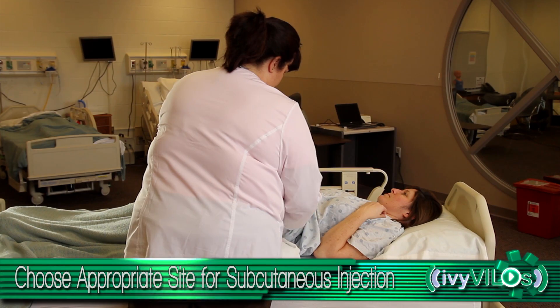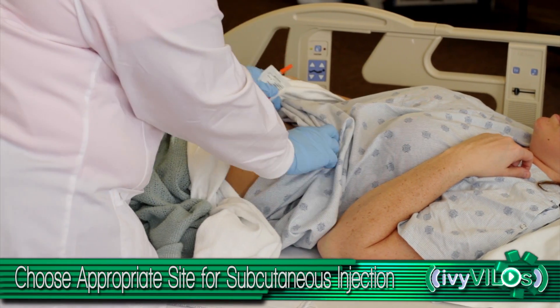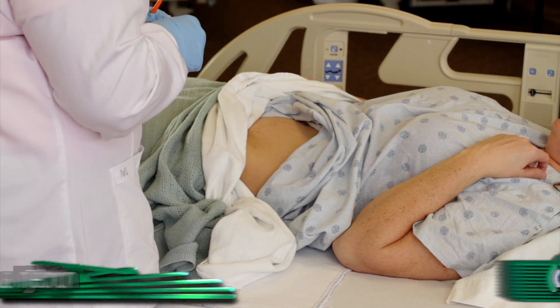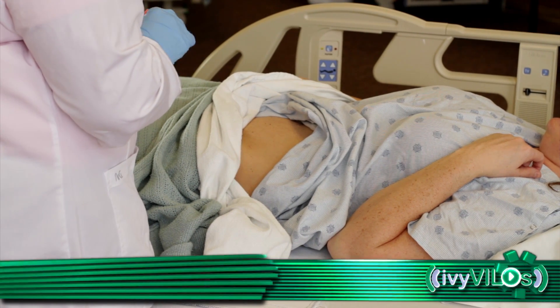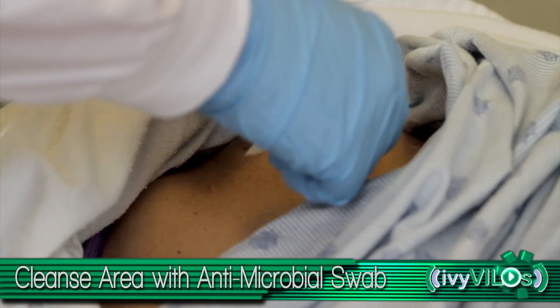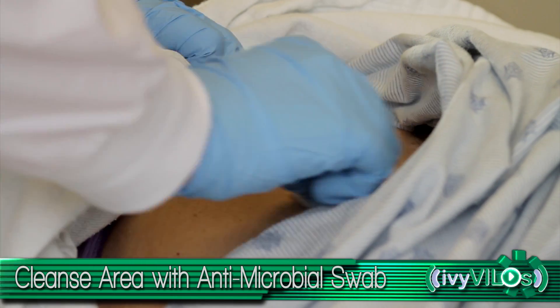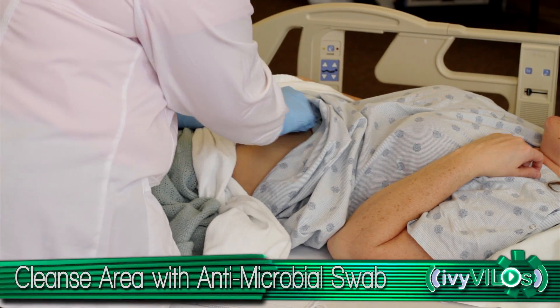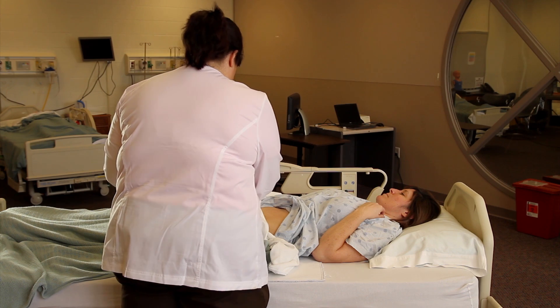Choose the appropriate site for subcutaneous injection. Cleanse the area with an antimicrobial swab using a firm, circular action moving outward from the center. Let the area dry.